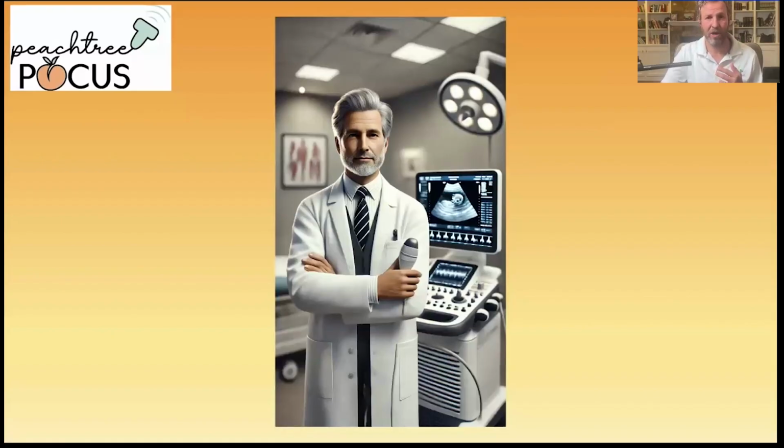But if I'm running the code and I have a senior resident who I know is competent with ultrasound, I'll let them take on the sonologist role. Point is, give ultrasound to someone with experience if you can, and keep the role clearly defined the same way as you define a team leader, an airway, medications for nurses, IV, etc.